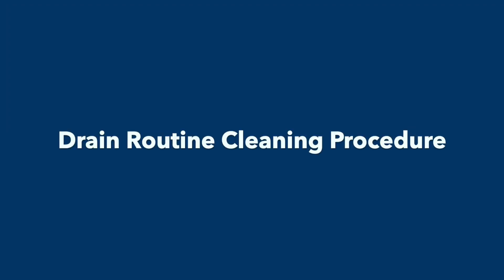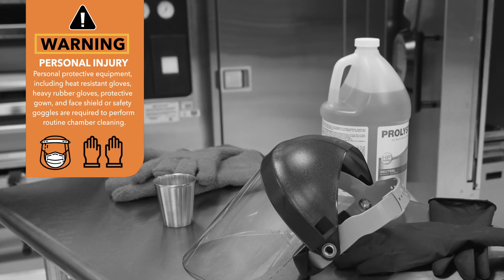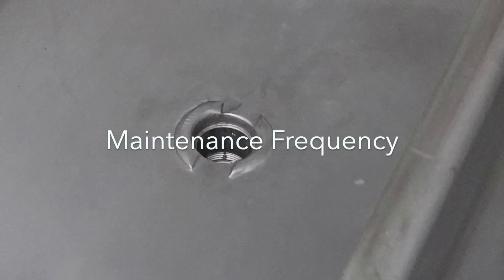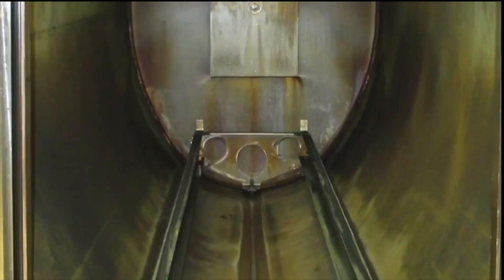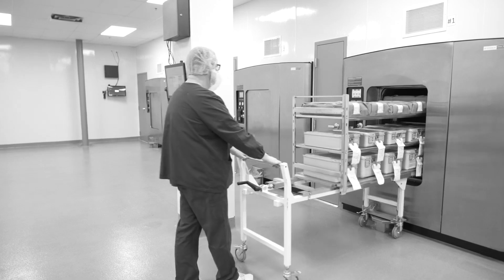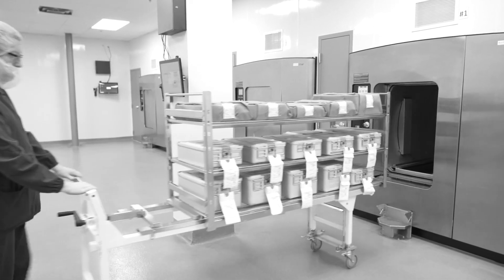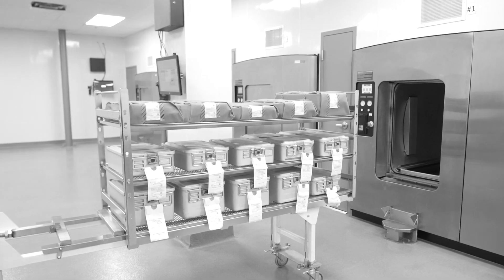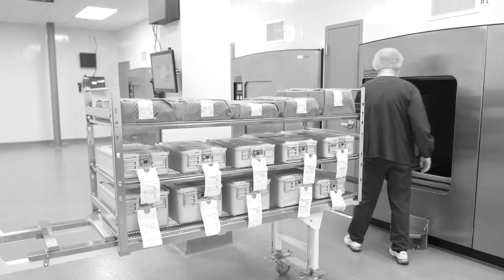Drain Routine Cleaning Procedure. Drain Cleaning Frequency: If liquids such as microbiology media are processed in the sterilizer on a regular basis, the chamber drain should be cleaned once a week. The drain should also be cleaned following chamber cleaning to remove any debris resulting from the cleaning process. The drain should be cleaned whenever it becomes clogged.